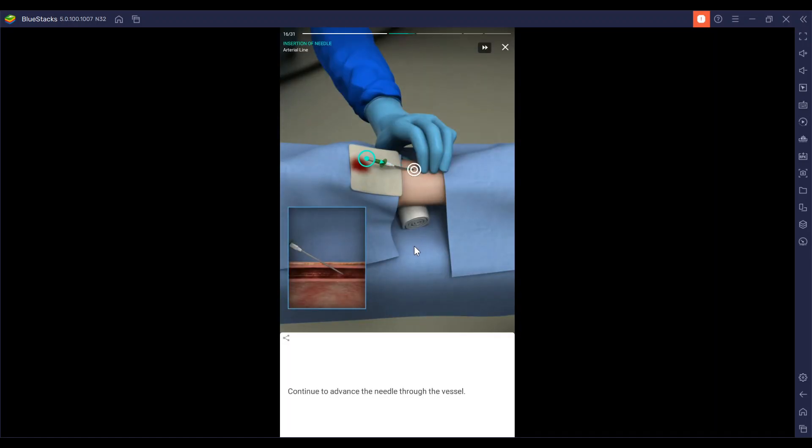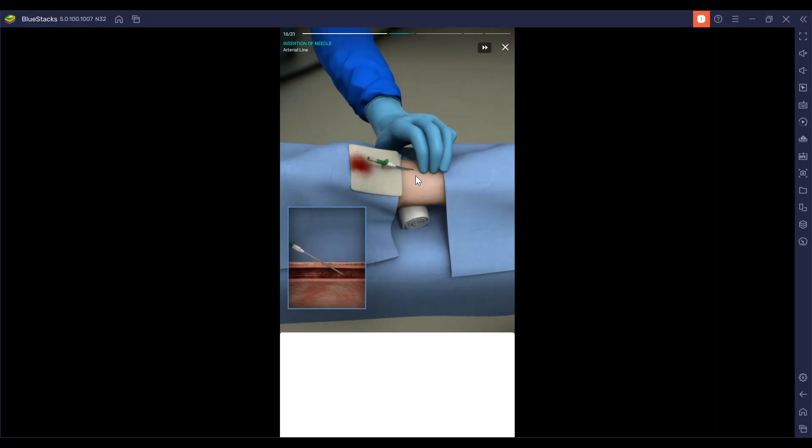If there is no blood flow return, withdraw the needle and reattempt using a different trajectory or use the ultrasound machine to locate the artery. Now we're going to continue to insert this through the vessel.